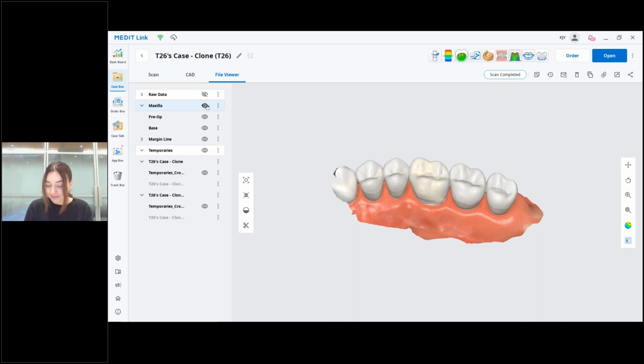Really, really neat. And I love all the testing that's going into this. I think an amazing thing about Medit is the extensive testing and planning that happens to release something like this. You guys, I always say I don't think you get enough sleep there, but we're grateful for what you and the team do. Yes, especially our developers, an amazing team that goes the extra mile to create automatic testing and all of that, to make sure that a crown that goes inside a patient's mouth is something that our users can trust. So hopefully you enjoy using this app.